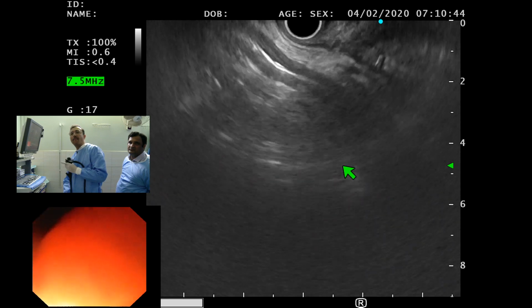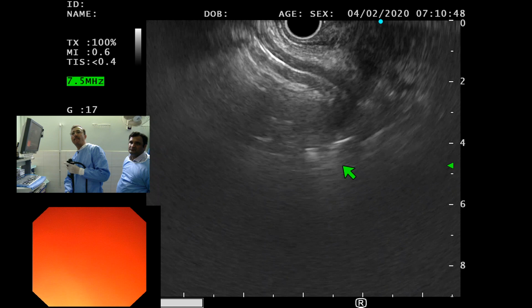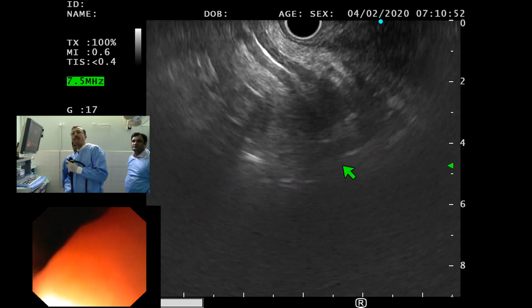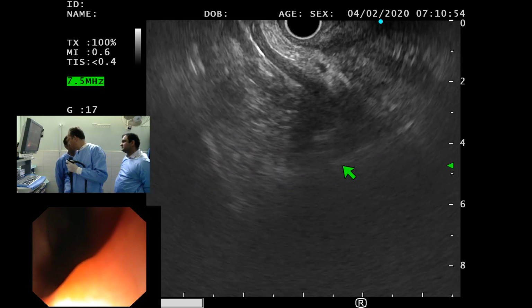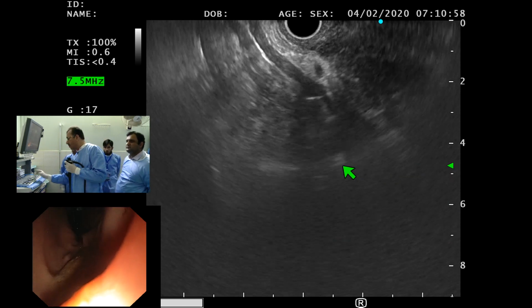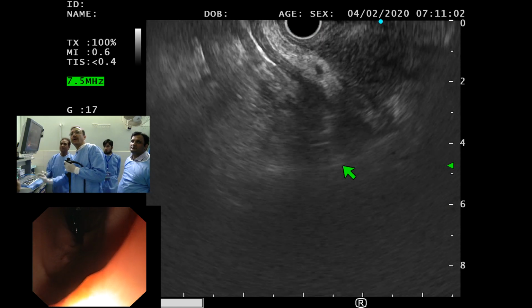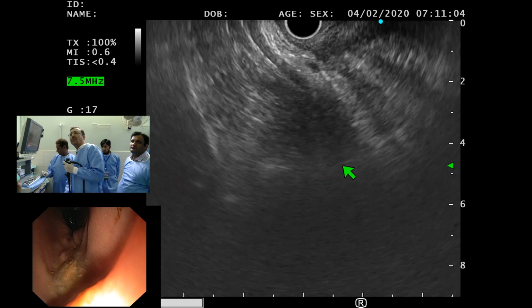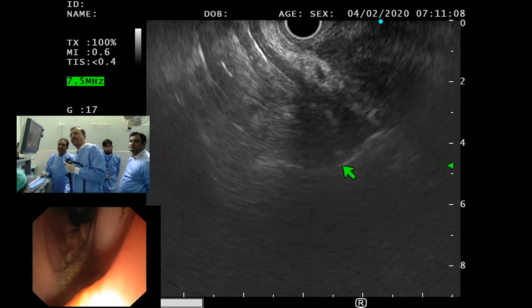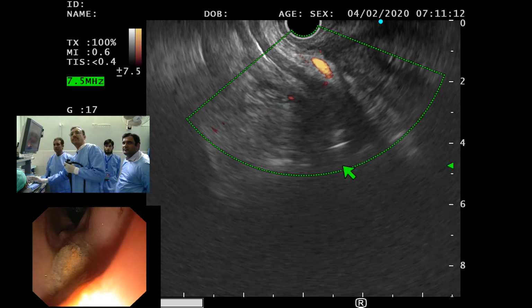Can we have the flow on here? The audience wants to see what these structures are. Okay, they can switch to the next room while we try to figure out.